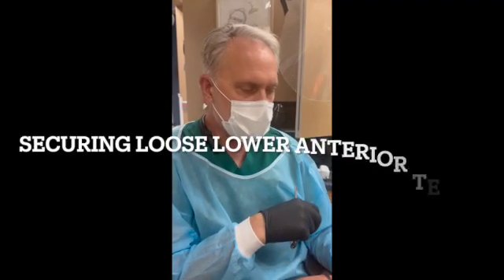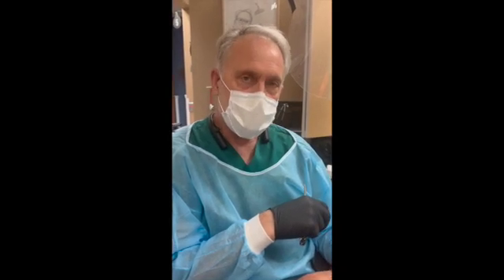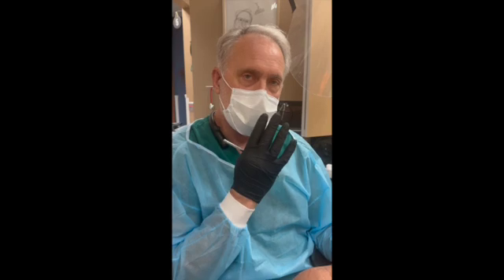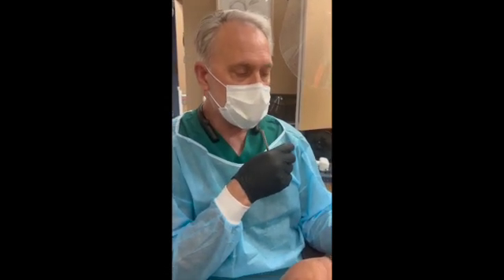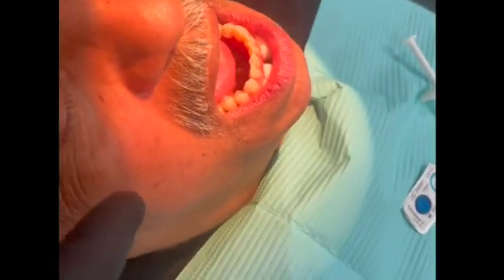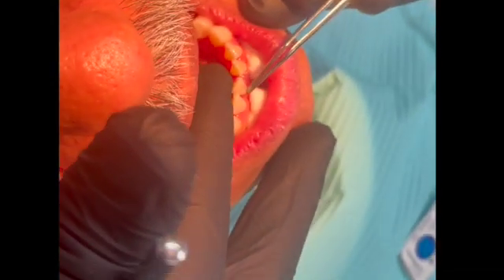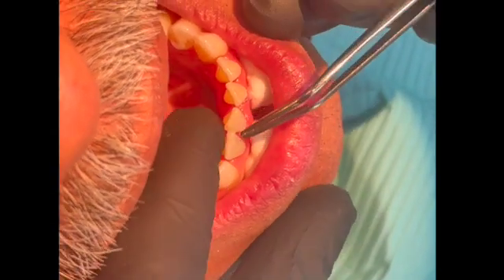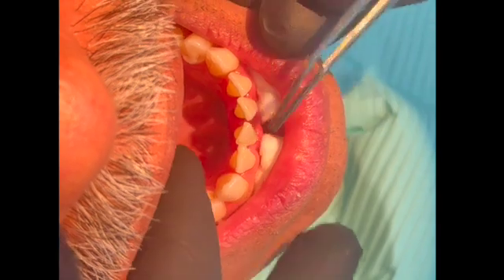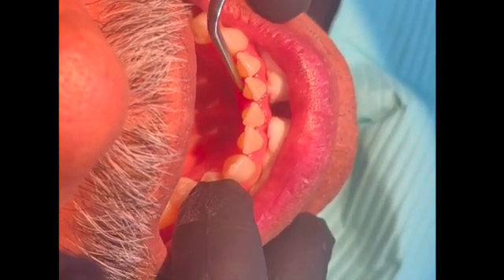Today we're talking about a common problem where the patient has some loose lower front teeth, either from bone loss or past gum disease. This patient has a couple of teeth he was concerned about that have gotten loose, especially these two, but all these lower front teeth are a little bit loose. We're going to bond these teeth together.